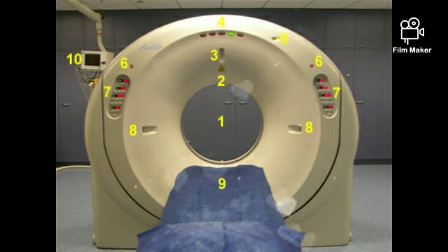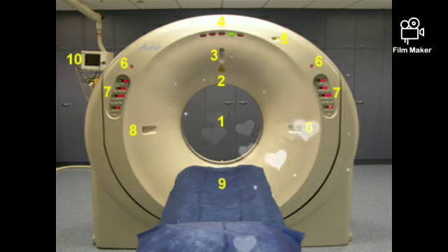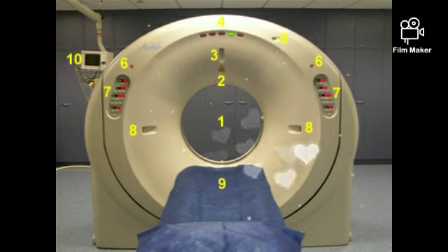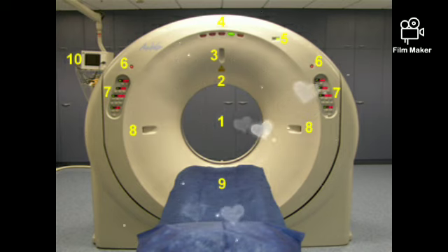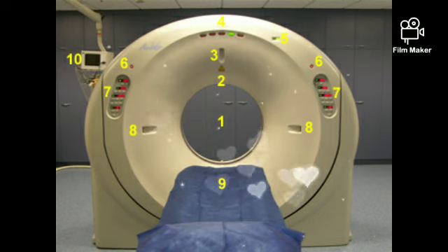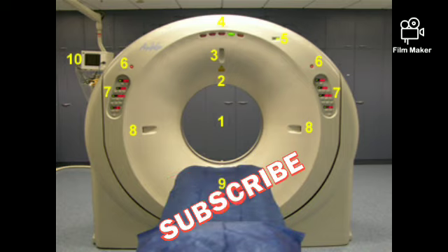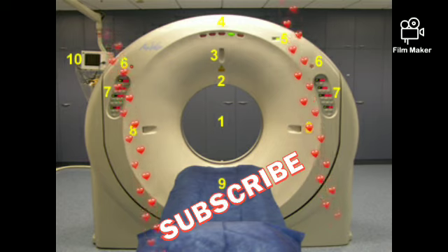Okay, next, number two is the area where there is the microphone. Once you give any instructions, the patient can hear, and he can also speak during the exam. Number three is the area from where the X-ray comes out, and that is in the form of a point source. Number four is the display panel where you can see the display of the items. Number five is our scanner indicator, which indicates when X-rays are on. Number six is the emergency stop button.